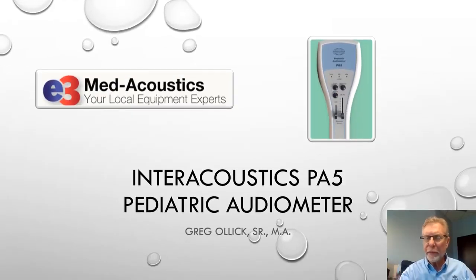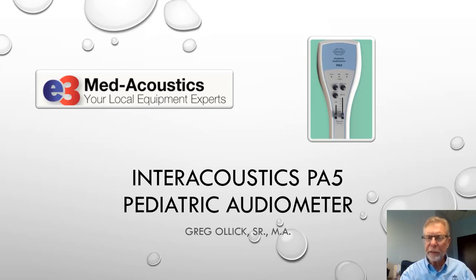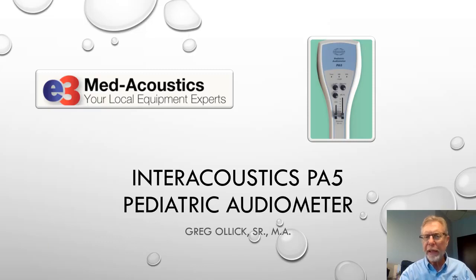I'm Greg Olick from Med-Acoustics, E3 Med-Acoustics, and I would like to explain to you the operation of the Interacoustics PA5 Pediatric Audiometer.